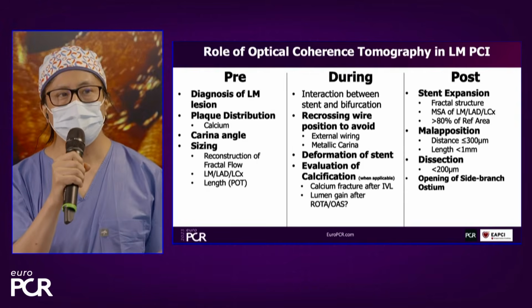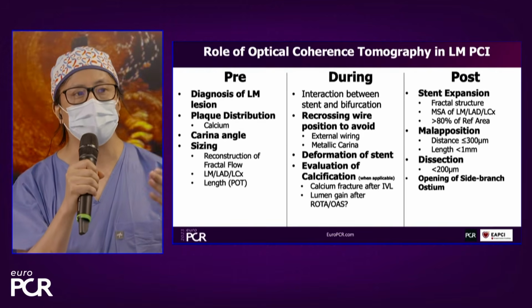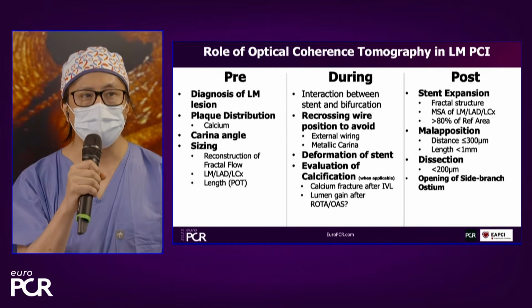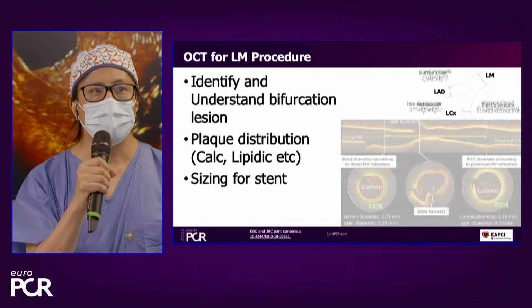Yeah, so this is the role of optical coherence tomography and OFDI in left main PCI. In general, before the procedure, you can really do the diagnosis, looking at the plaque distribution and carina angle. There is a role during PCI and also after the procedure. Go next slide, please.